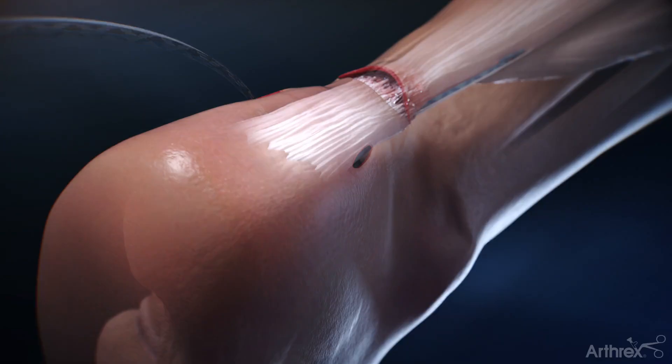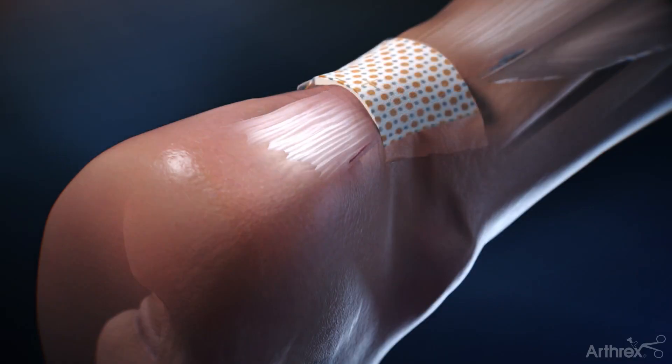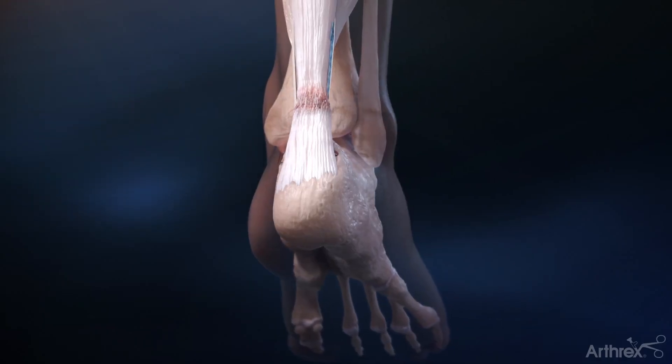The same steps are repeated for the suture tapes on the contralateral side. The incision is closed. Jumpstart antimicrobial dressing can be utilized, and the result is a secure knotless repair of the Achilles tendon rupture.